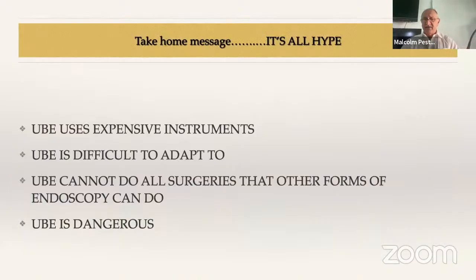Take home message: yes, UBE is all hype. UBE uses expensive instruments? No. It uses a 30,000 rupees Chinese scope. It uses a Saraswati 90,000 rupees burr. It uses Abbas Bhai's Mactronics 60,000 rupees pump. It uses all your simple spine instruments. I don't require setups worth crores of rupees.